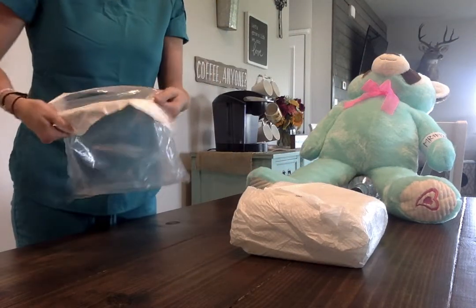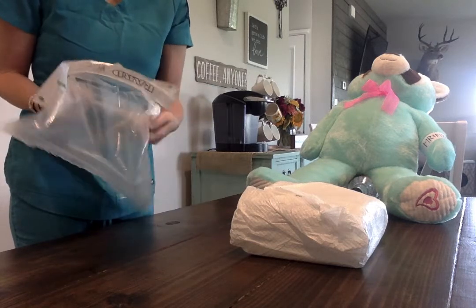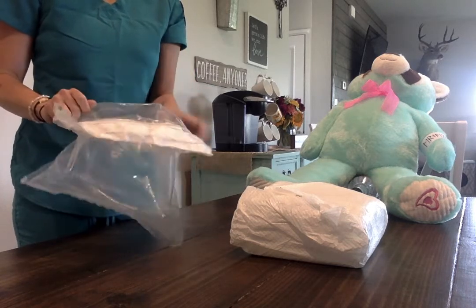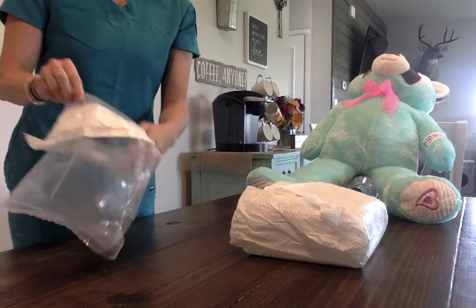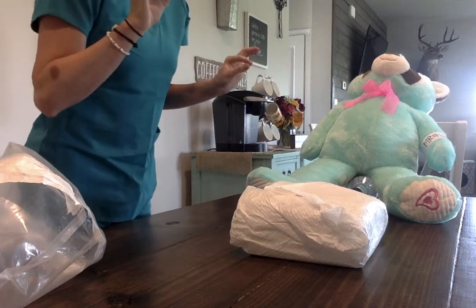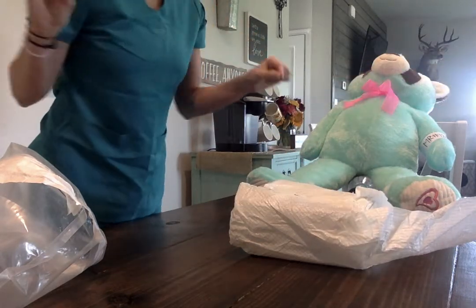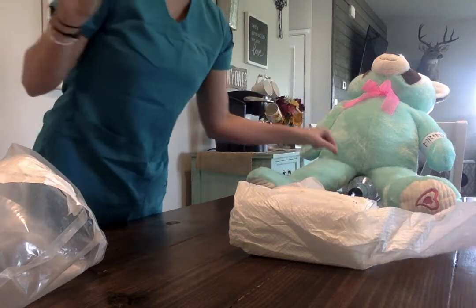Start by making a trash can. This bag. Okay, right there. And by picking up the corners, the edges, not touching anything, I'm going to open this.